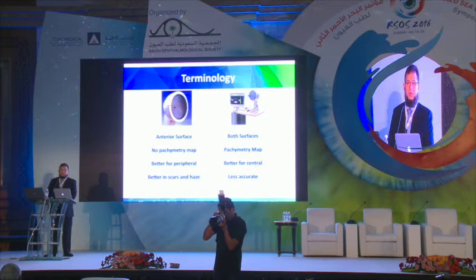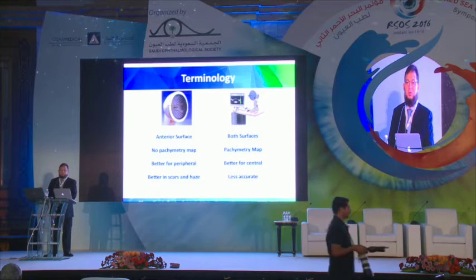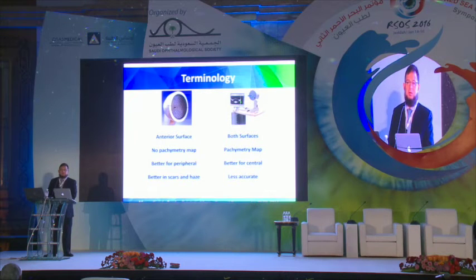When we have any corneal scar, even a subtle scar like post-PRK haze, the tomography is not accurate, especially in the pachymetry map. It is not accurate because of the scattering of the light. While topography can give us better details for the anterior corneal surface in case of haze and scars.